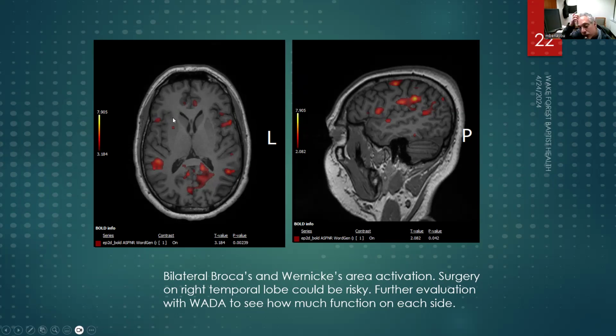And ironically, this was one of the first fMRIs I read as a new attending at Wake Forest. When I came to Wake Forest, they actually had stopped doing fMRIs because they said they were less helpful. And so here I was, the brand new attending right out of fellowship, and I did one of these, and I said to them that I was concerned that the patient had language distributed into both hemispheres, which is pretty rare.